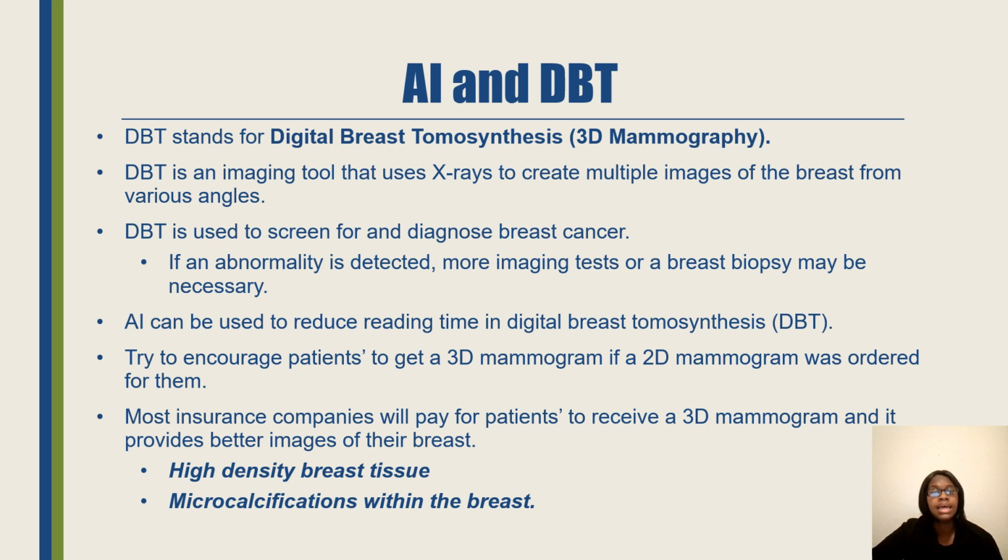Now with AI and digital breast tomosynthesis, which is a 3D mammogram. So we do try to encourage patients to have a 3D mammogram, especially if a 2D mammogram was ordered. A 3D mammogram just shows a lot of the breast tissue, especially if a patient has small calcifications in the breast or dense breast tissue. So a 3D mammogram is very important, and in combination with AI, it can reduce the reading time with digital breast tomosynthesis.